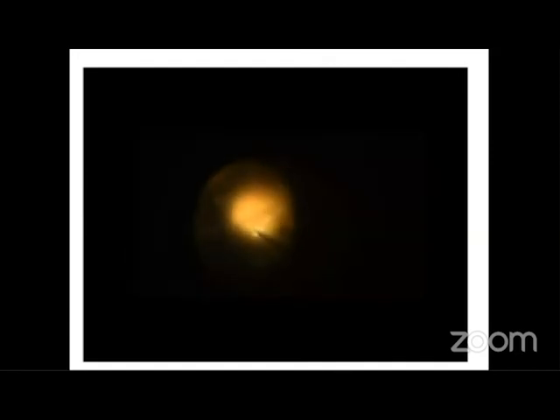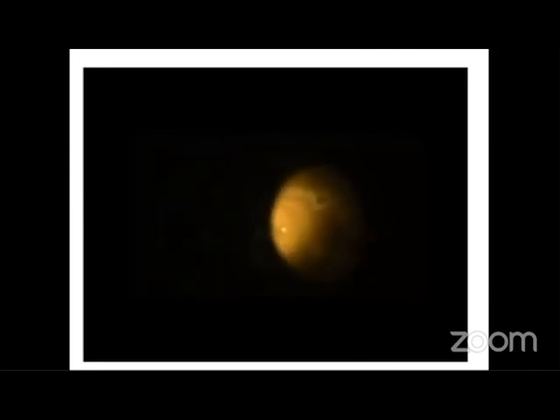After core vitrectomy, PFCL is injected. A relaxing retinotomy is done temporally. Endolaser and gas exchange is done.